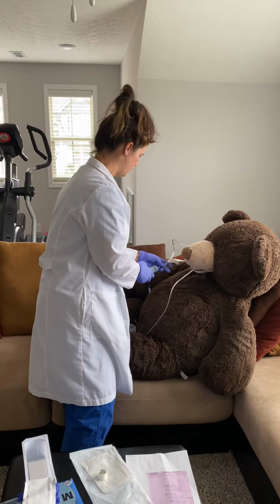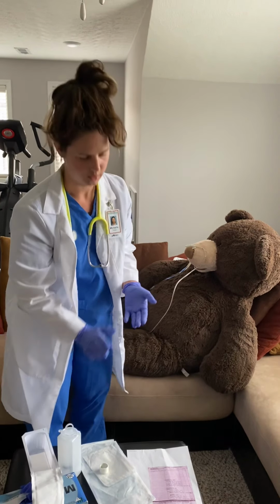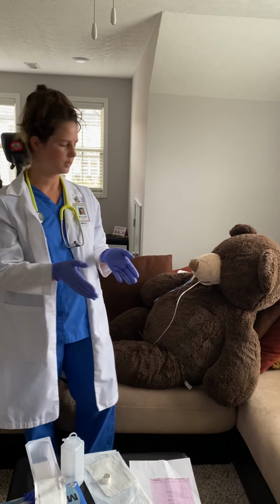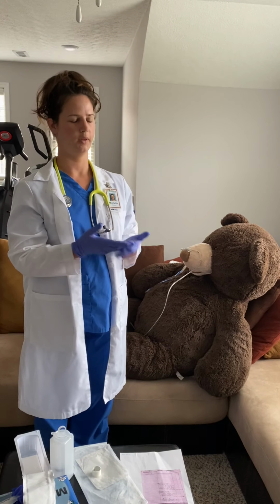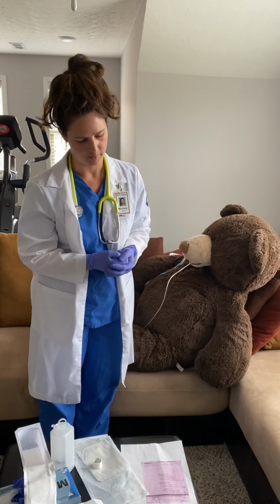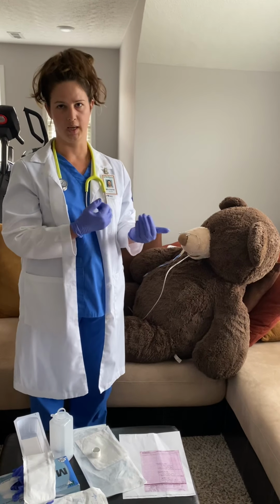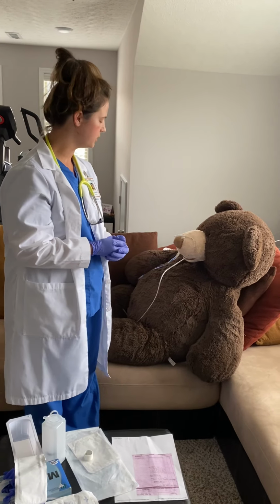Okay? All right. Lastly, we're going to be administering Glucerna. So we're going to be doing gavage. For this, again, you want to confirm placement. Before starting that, you want to look at the feeding that you're administering. So we're administering Glucerna, 1.5 cal, 100 mLs, and we're going to be flushing with 50 mLs of water. And always flush before the feeding and after the feeding, clearing any feeding in the tube.